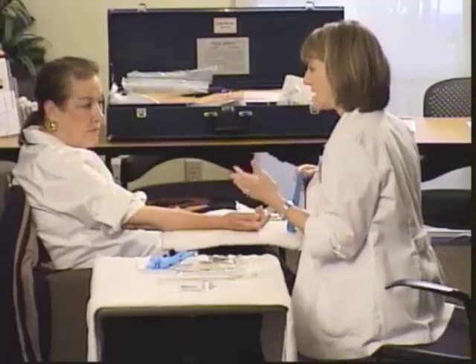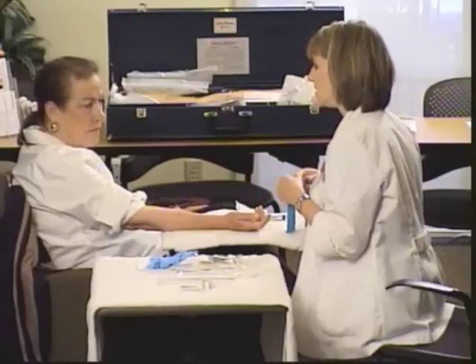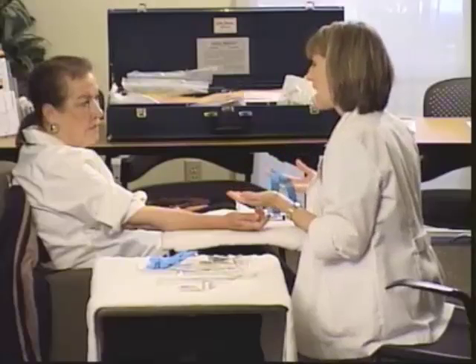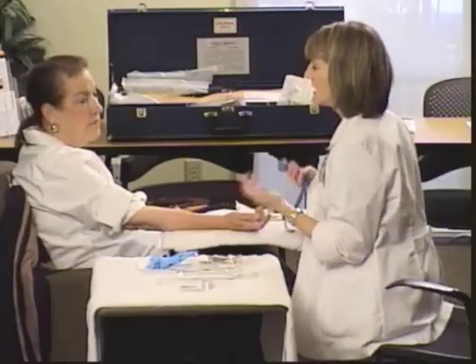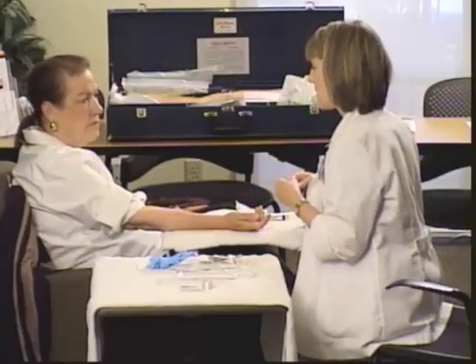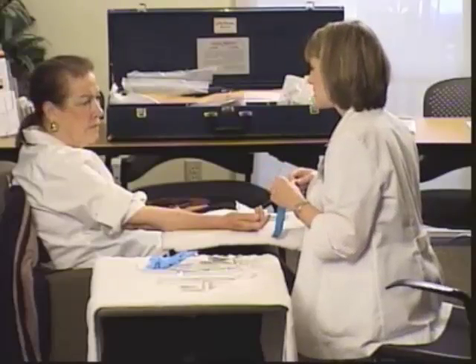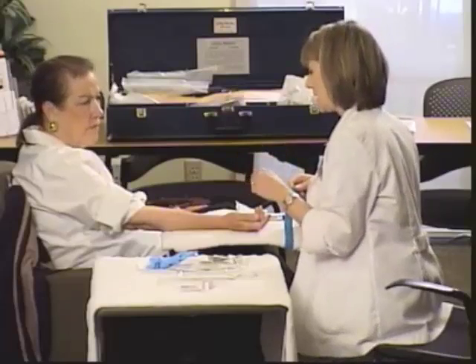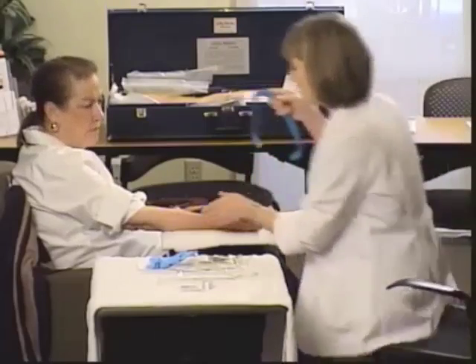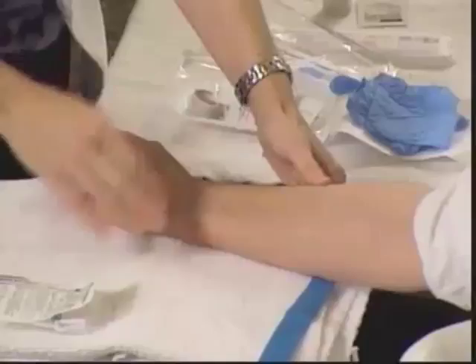You've talked to the resident, explained what the physician has ordered and what you need to do. After identification, I'd be asking: are you right-handed or left-handed? Then make choices about which arm to look at first. This is the part you don't want to rush through — it's well worth the time to really put the tourniquet in different places and make sure you've got the vein you want. I've done a little looking already and decided on this arm.